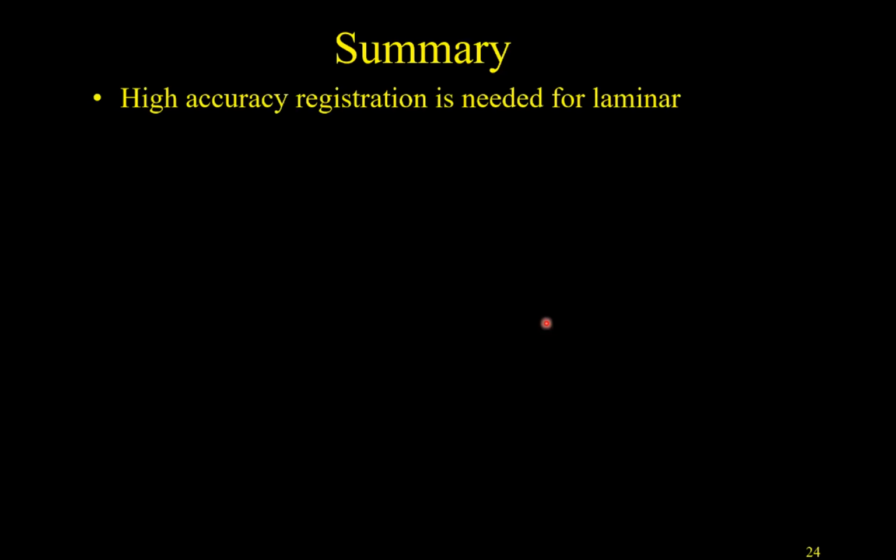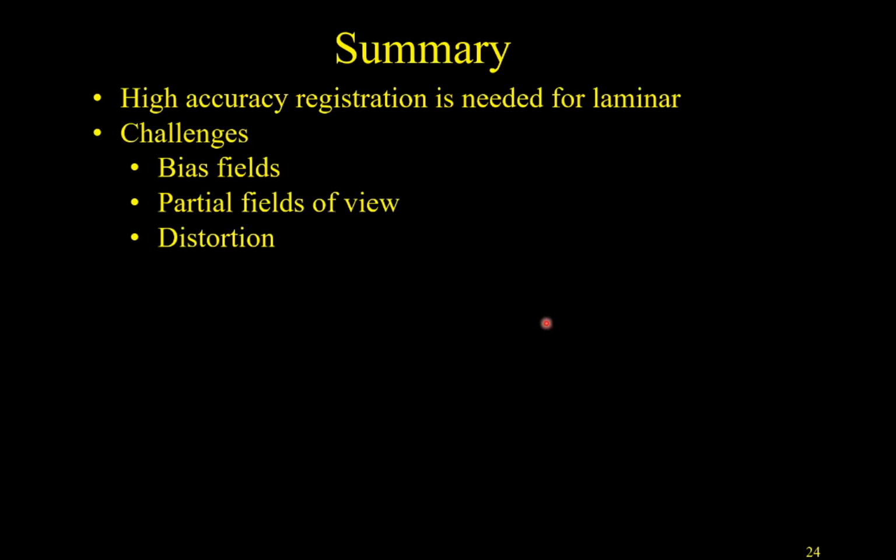And so to summarize here, we obviously need extremely high accuracy registration for laminar analysis. But we are challenged by bias fields and partial fields of view and distortion.